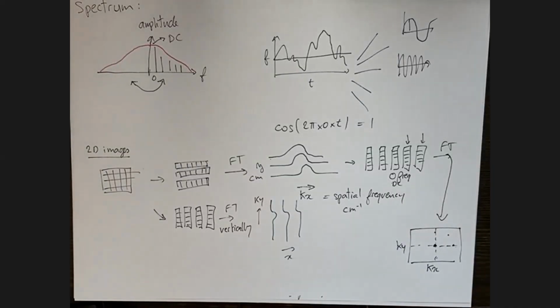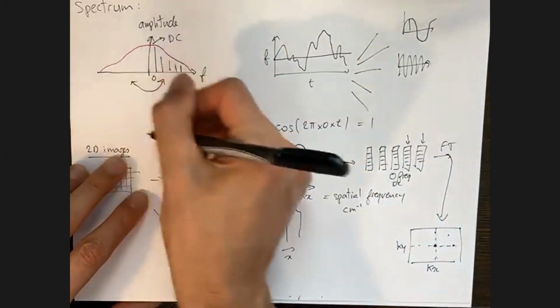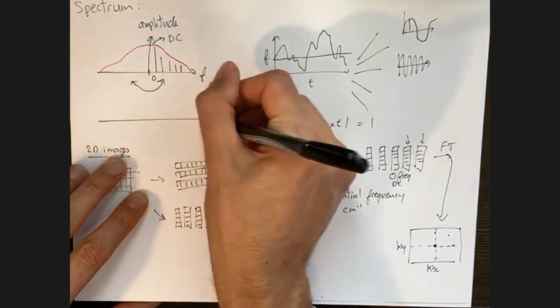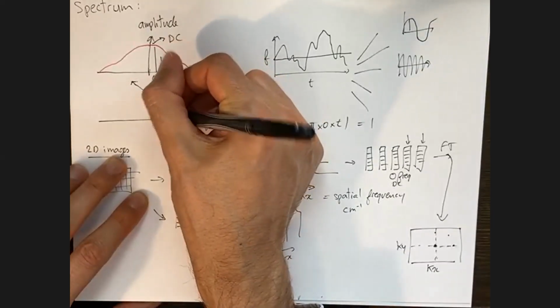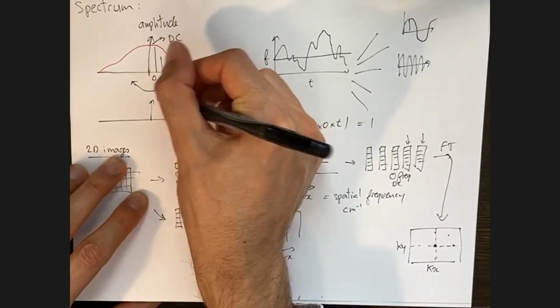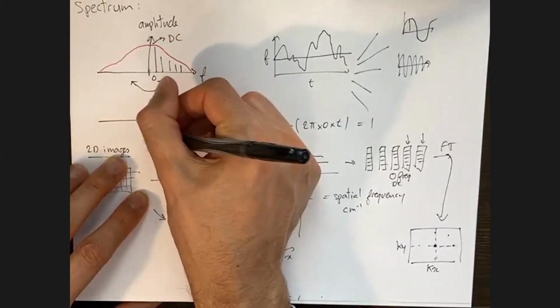Okay, so now we're moving back here. In those spectra, I wanted to mention that I'm really showing only the amplitude information. But as you recall, there's always phase information as well. So I should also add that as a function of frequency, we can also plot phase, and phase will be between -pi and pi.